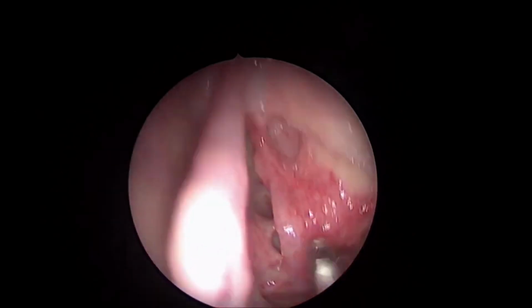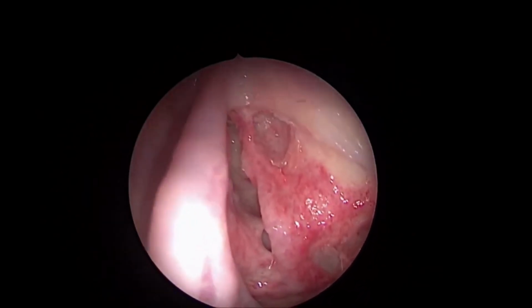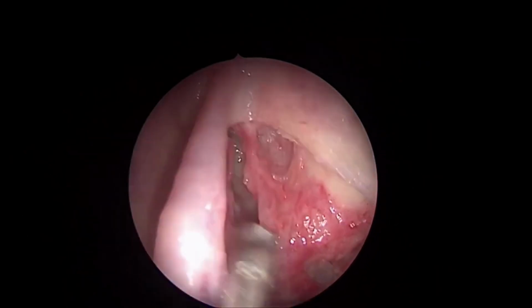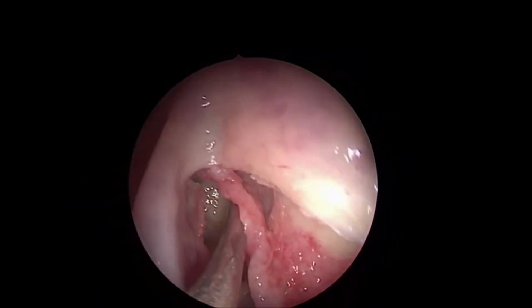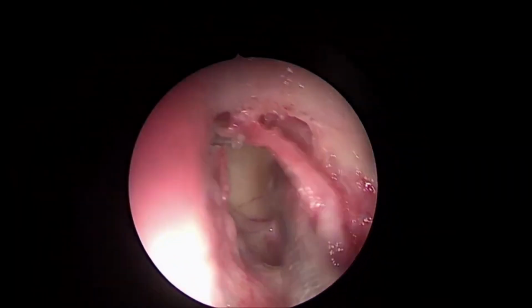So for any cells which are in the anterior wall of the frontal recess, the basic fundamental to the surgery is go behind them. See this? Like this agger nasi, I am going behind that and fracturing it out. Can you see this? Yes, sir.